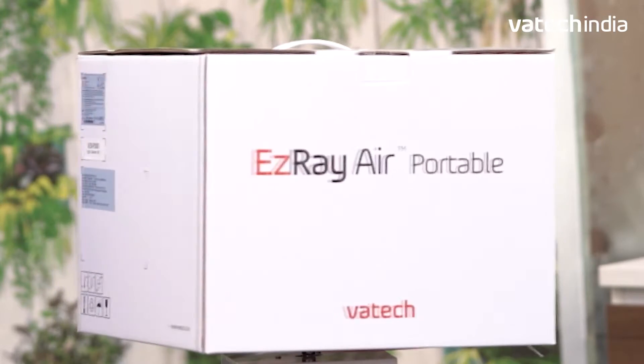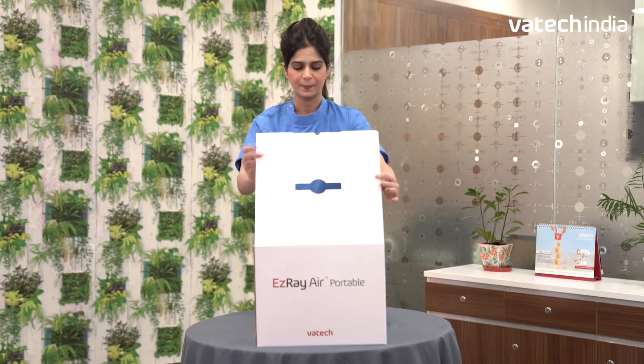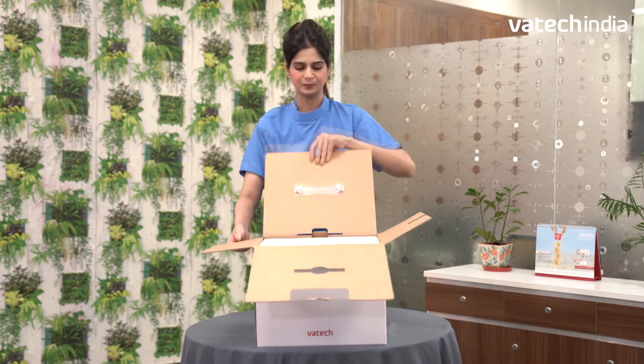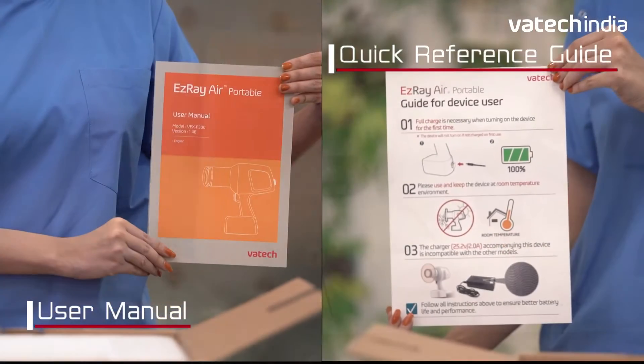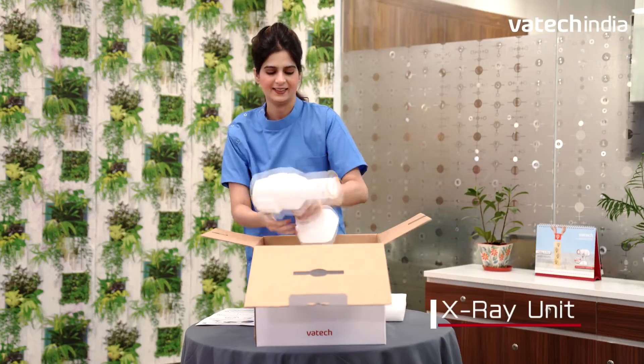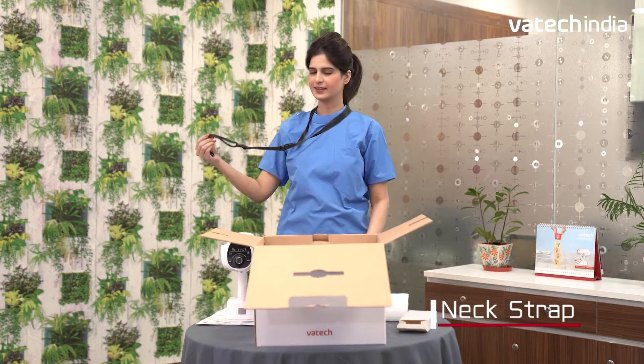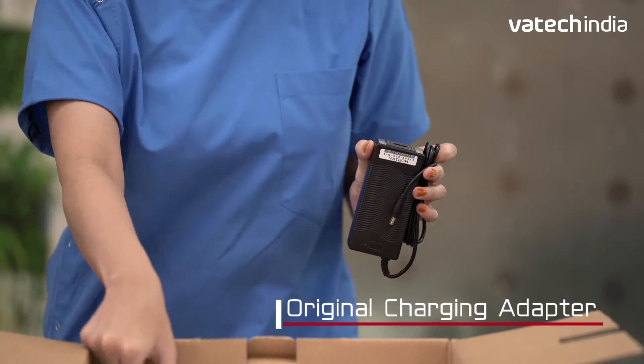EZ-Ray Air Plus from Vatakindaya comes with premium quality packaging. The packaging includes an instructions manual, quick guide, and the unit itself is smart, comfortable, and easy to handle. The accessories include a neck strap and charging adapter.